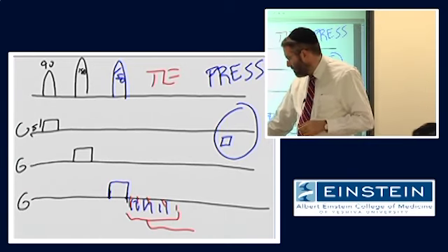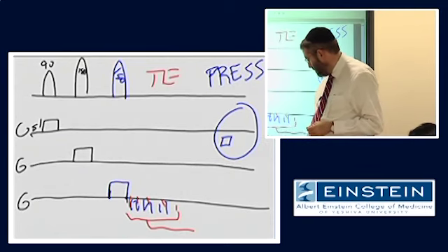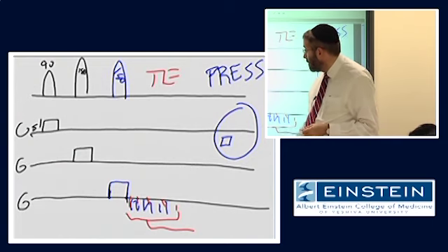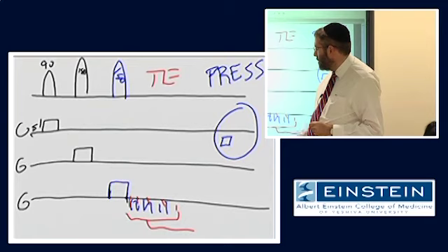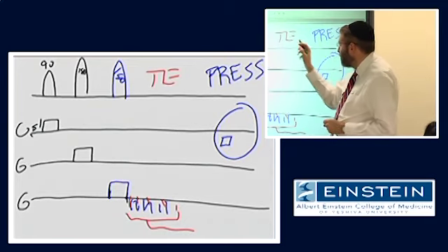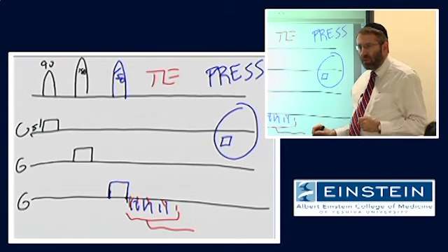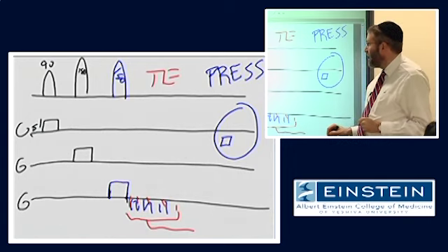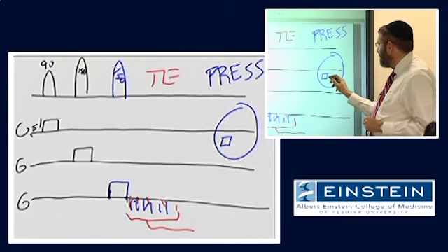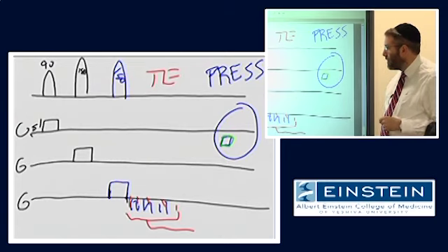Well, it turns out that if we make an additional change here, which is that in addition to this slice select gradient, we run through this to generate a single proton spectrum. And what that means is that we now have information coming from basically a single location in the tissue.